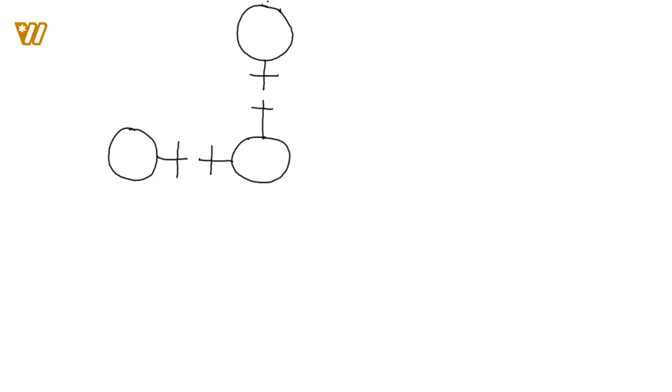And so the whole concept with manual keratometry is that how a manual keratometer measures the curvature of the cornea is that it thinks of the cornea as a mirror. And what you do is you actually reflect these mires, are what they're called, but these circles with the lines in them, you actually project those onto the cornea, and then you get a reflected image. And what you do with the dials whenever you move those, right, is that you're actually measuring the size of the reflected image, right? So my question to you is, we've got three circles to look at.